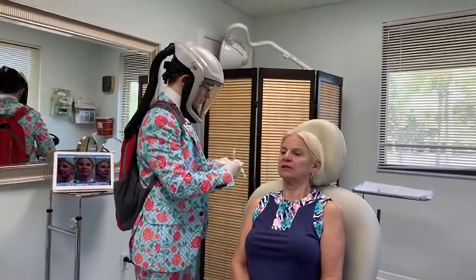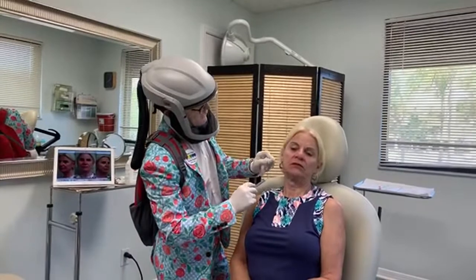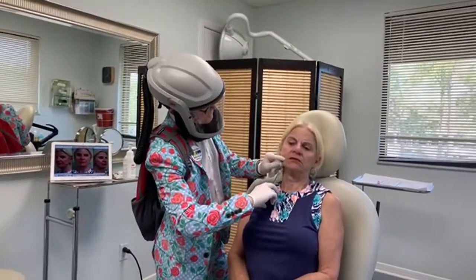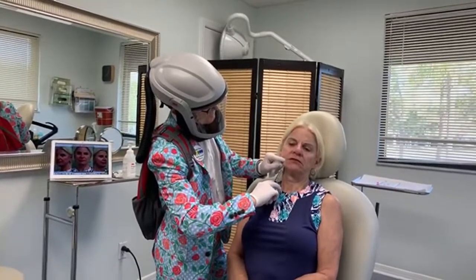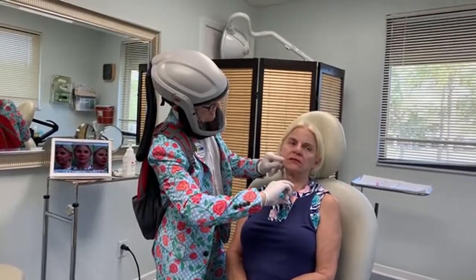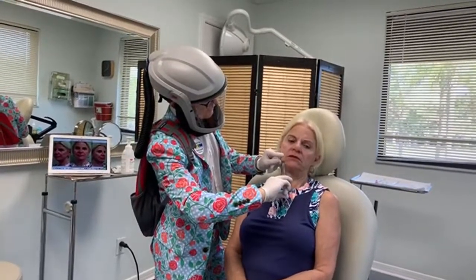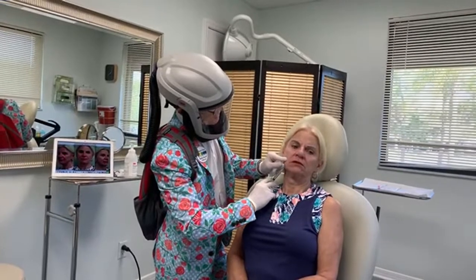So I use the little buzzer device. So I'm going to turn your head this way just a little bit. So you're going to feel buzz and then pinch on 3. 1, 2, 3, pinch. So we're doing a little bit of a field block. We'll go slowly. It's a little sensitive, but once I do the numbing, it's easier for her to tolerate the fillers. You feel small, medium, big pinch, not too bad? No, not bad at all. A little bit of numbing. We're not in a hurry. Buzz and then pinch. 1, 2, 3, pinch.